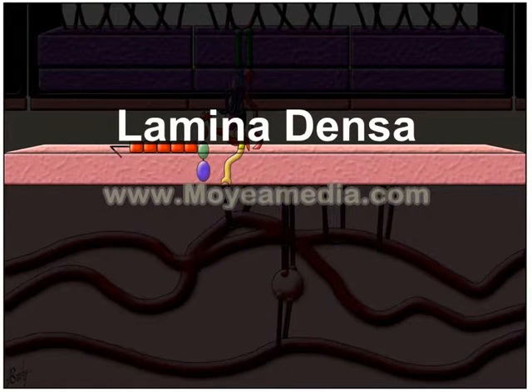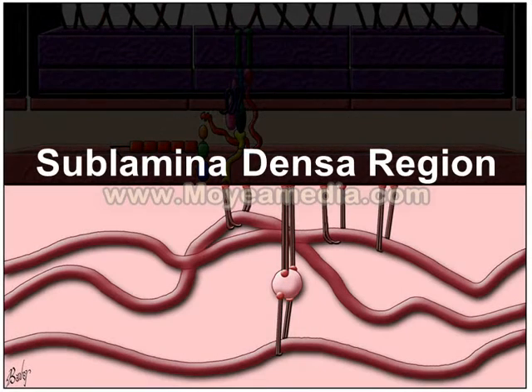Below that, the lamina densa, visible as a dense line in electron microscopy. And then the components within the sublamina densa region. These become especially important in immunobullous disease because we define the diseases, know how to treat the patients, and know what the prognosis will be based on where the immunoreactants deposit.